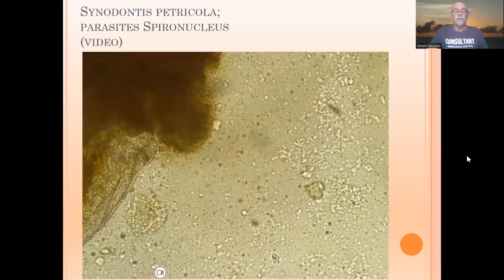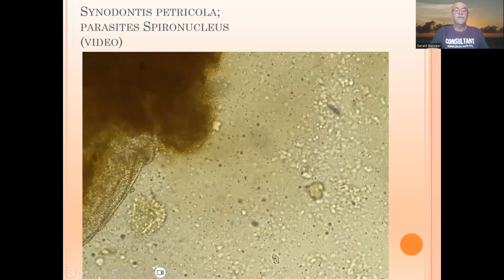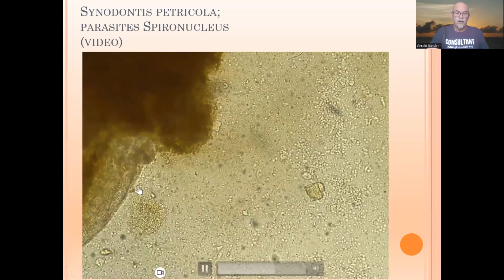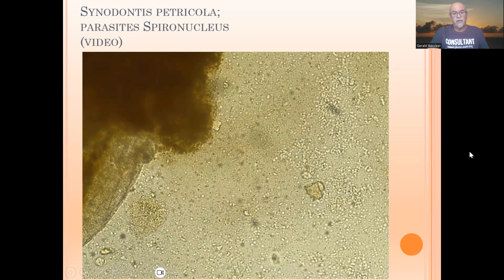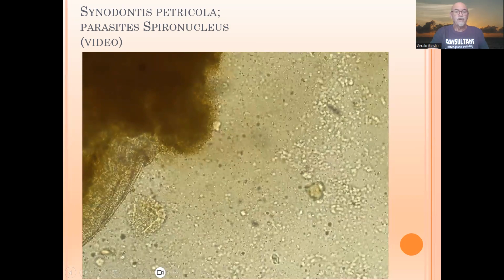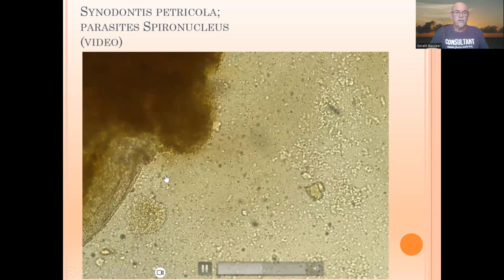Let's put the video on for you. You can see here the tiny parasites. Hard to see, you have to learn to see here. Next to the excrements which are here, you see the tiny parasites at a 200 magnification. And that's how you learn to recognize that these are things which are troubling the fish. Here we see it again. You see the tiny parasites?